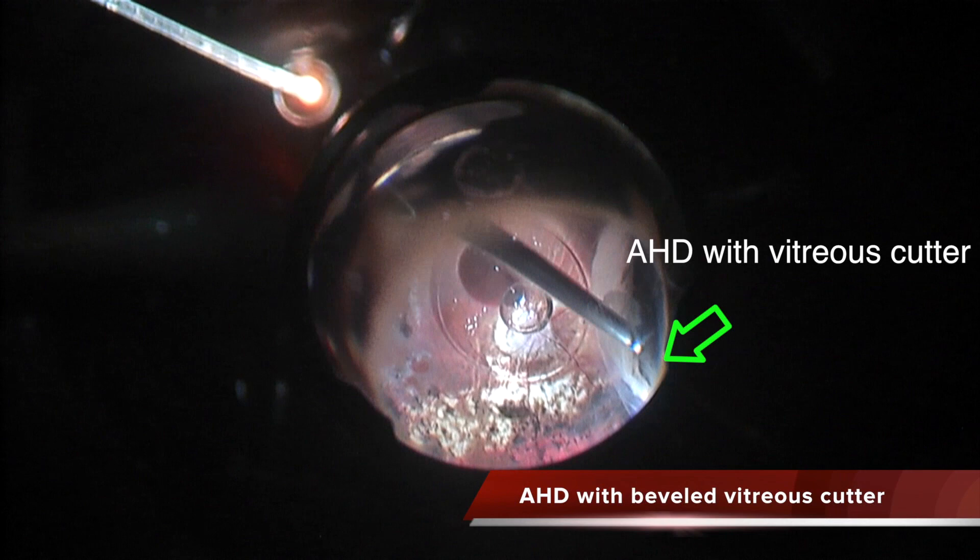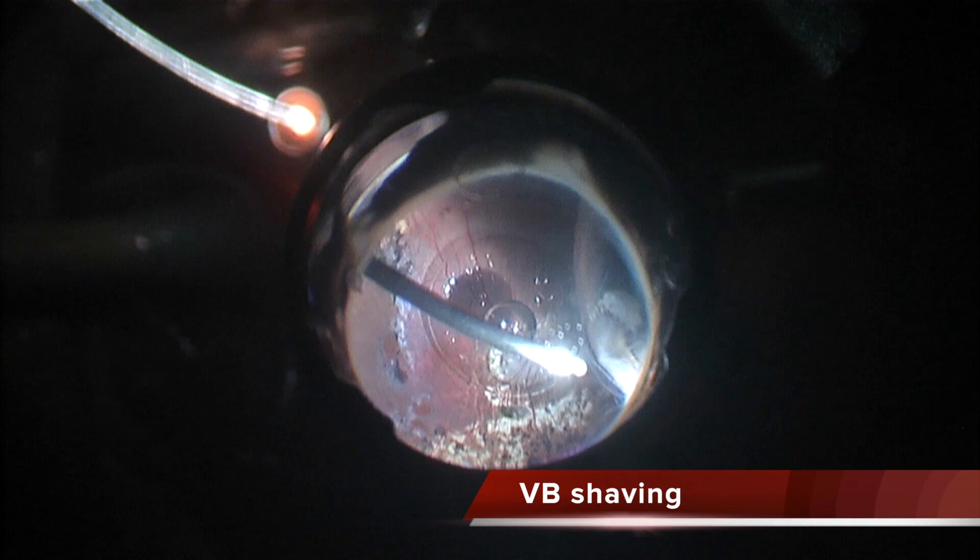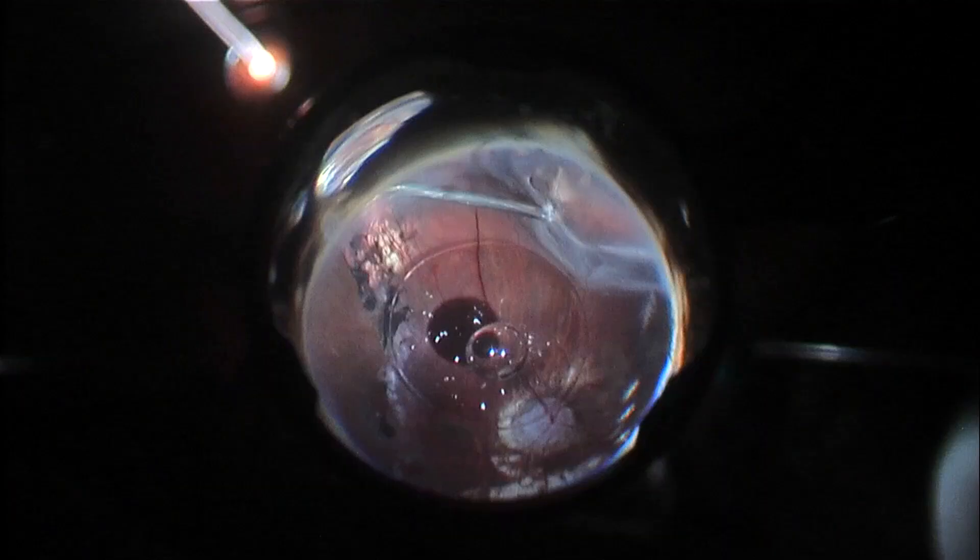You put the cutter into the subhyaloid space, cut across the space, and then pull back the anterior hyaloid, opening the space and relaxing the peripheral retina. This is the anterior hyaloid section technique. I then finish with a little more shaving of the vitreous remnants once the anterior hyaloid is removed. Now the pars plana is completely clean.